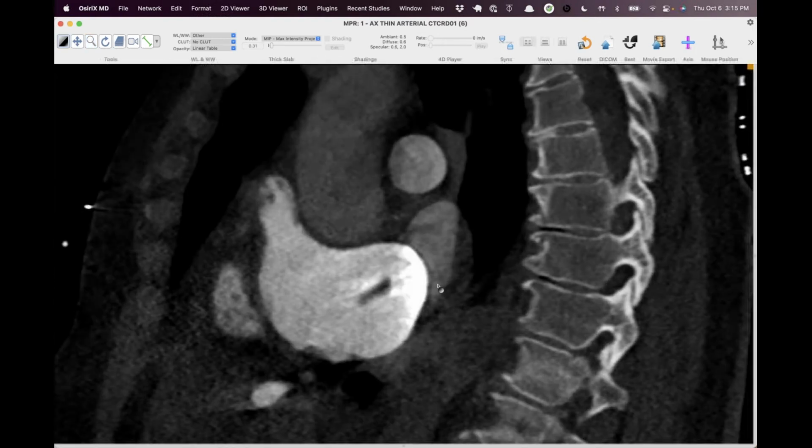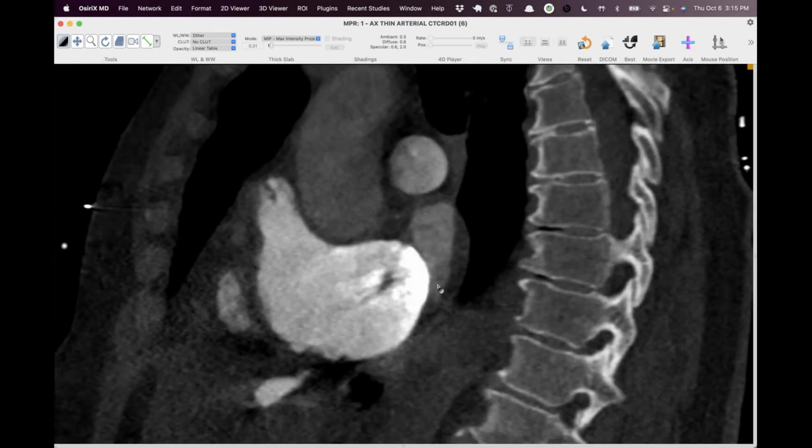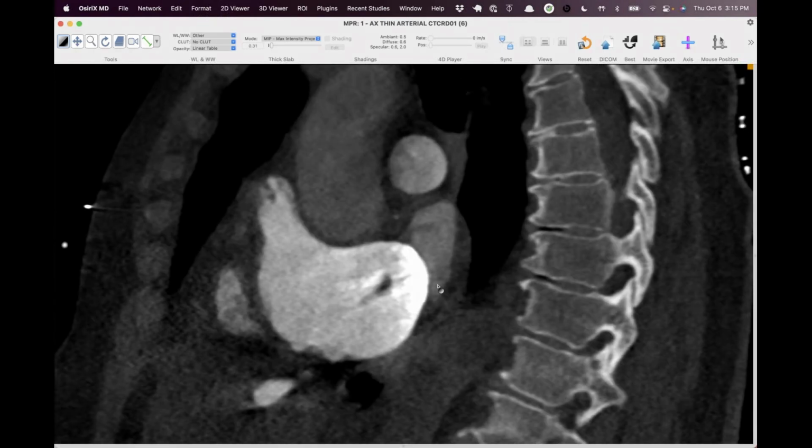We saw one case of this a few years ago, and we claimed it was like in flagrante delicto or something like that, caught in the act. It was actually published. But the fact that we catch them as often as we do suggests they must hang there for a while, right? I mean, it wasn't as if this thing was in transit for a few seconds, but it must have been hanging there maybe for hours or something.